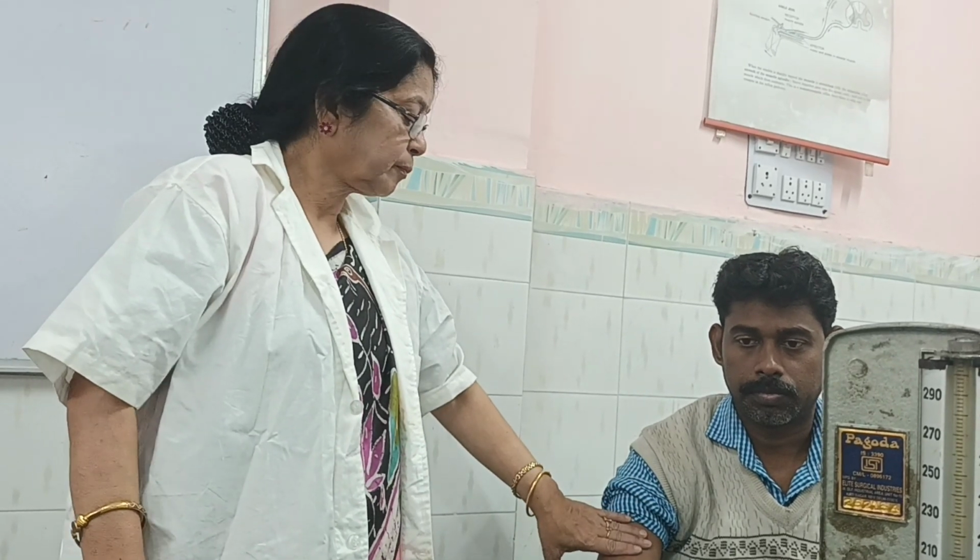Now, if the subject is in supine position, we can measure the blood pressure in supine position, and in the thigh or in the arm, the cuff is always at the level of the heart. In supine position, the cuff is always at the level of the heart in case of the thigh also. But in sitting position, we can measure only in the brachial artery, not the popliteal artery. So the position of the patient is supine, or maybe sitting, never standing, but the cuff should always be at the level of the heart.